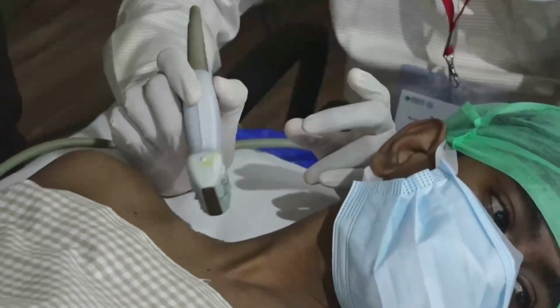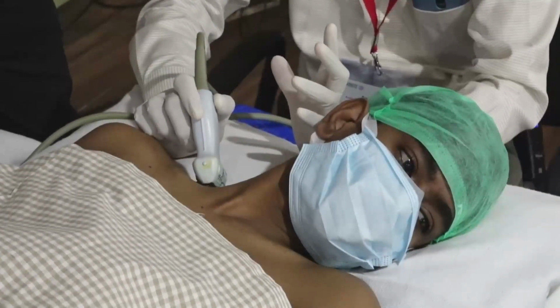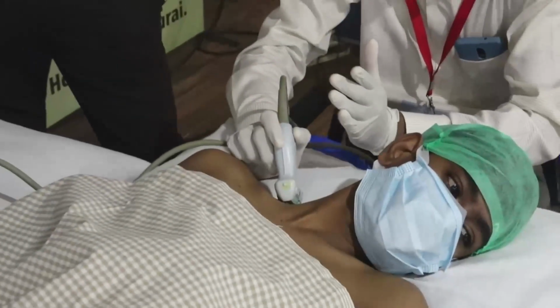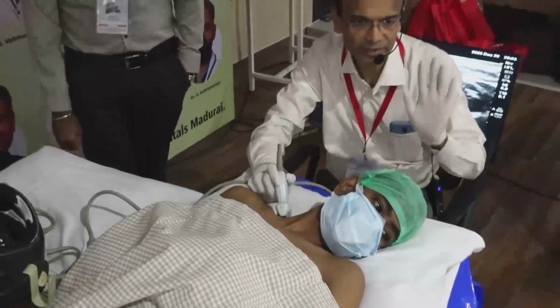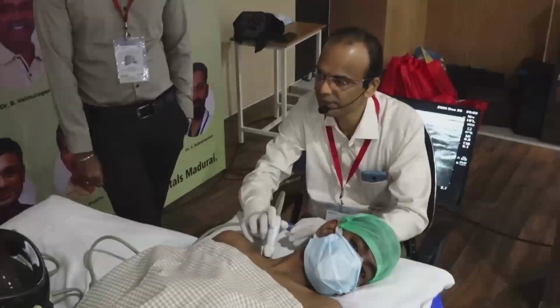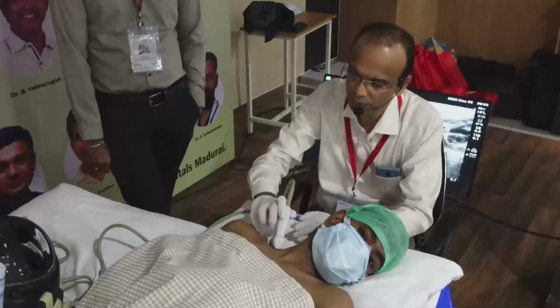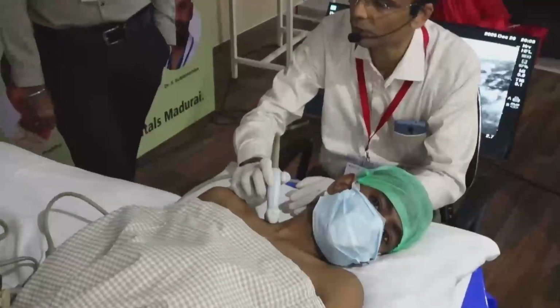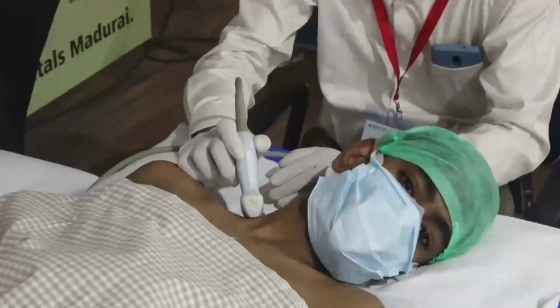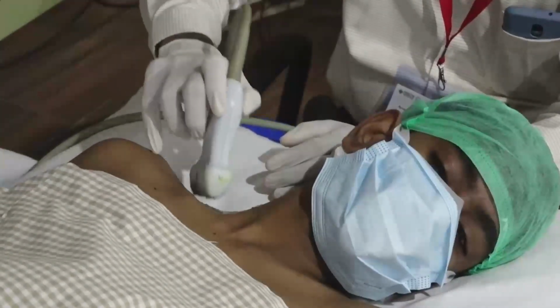The idea is to not miss anything, and if you face any difficulty, you can come back proximally and distally. Sometimes if it is difficult in the proximal area, you come to distal and sweep and see. Suppose you have difficulty in the proximal area, you come to distal and again go to the proximal area and scan. So I will move on to proper scanning.